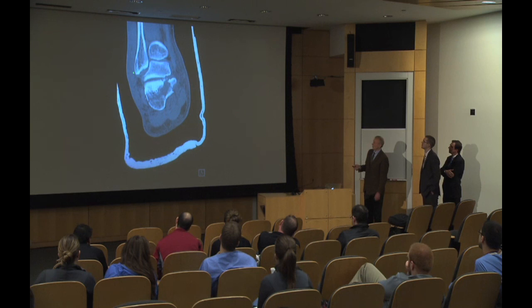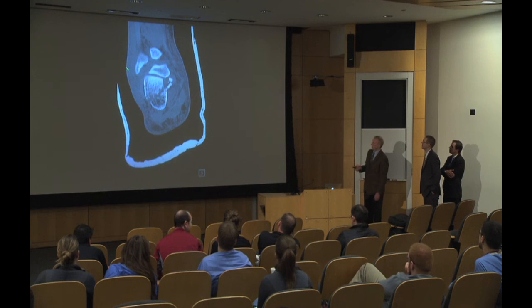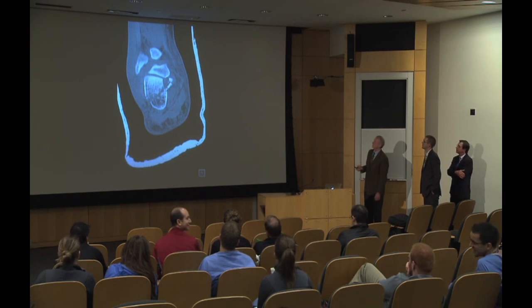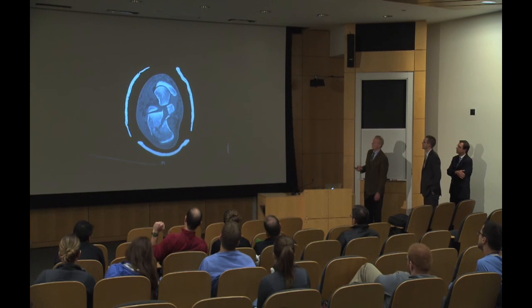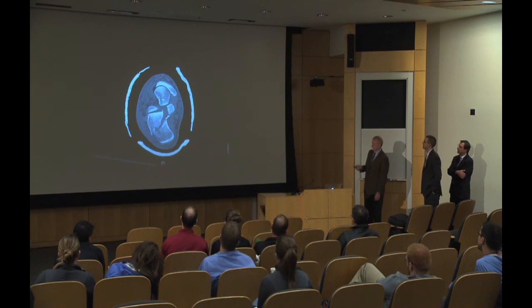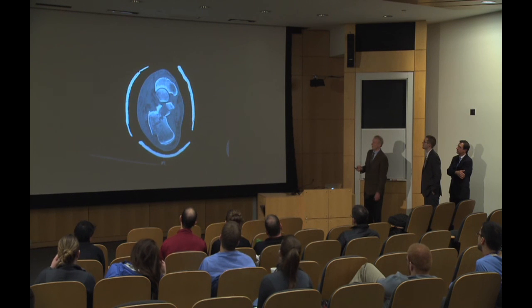The patient has a morphologic abnormality of the talus. This is consistent with a flat foot habitus. And there's some degree of impingement here, but I think there's still enough room for the peroneal tendon. So this is another one that might be managed closed, although it's unstable because the deltoid ligaments supporting the medial side are obviously disrupted. So you might argue to treat this open based on that instability on the medial side.